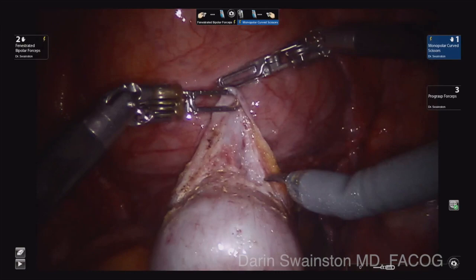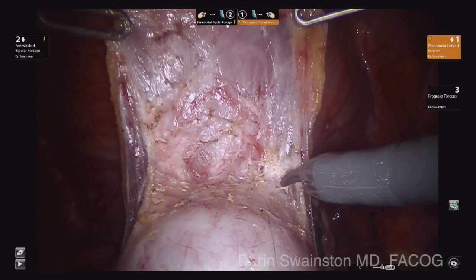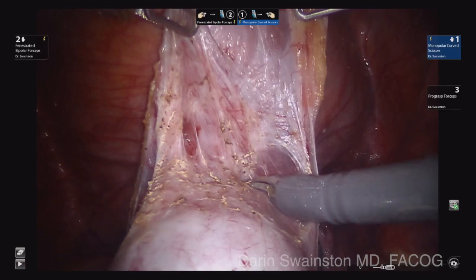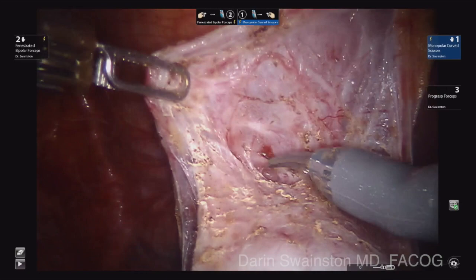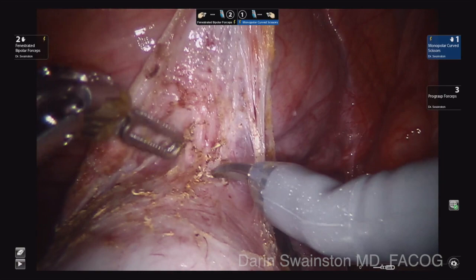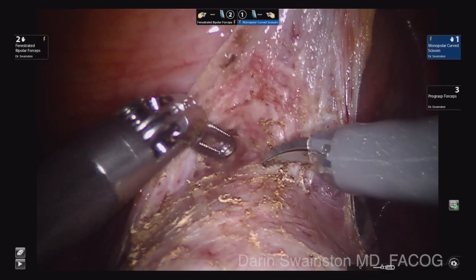This is very helpful. The assistant is positioning the UPS system near the sacrum. Once you push that foot pedal and position it, you can let go and it will maintain that position so the person can stay above. There are different ways of dissecting this out. There is the push-spread-and-pull technique — where you take the tip of the instrument, push it in, spread it, and then pull. I favor using more bovie especially when I know where I am, using the tip of the scissor to gently tease the area.